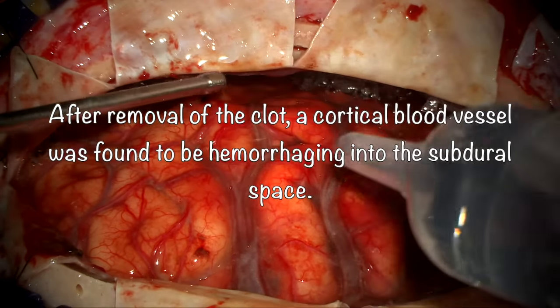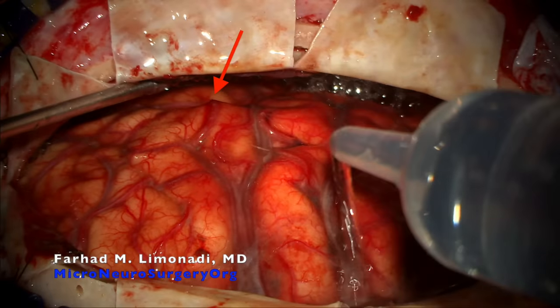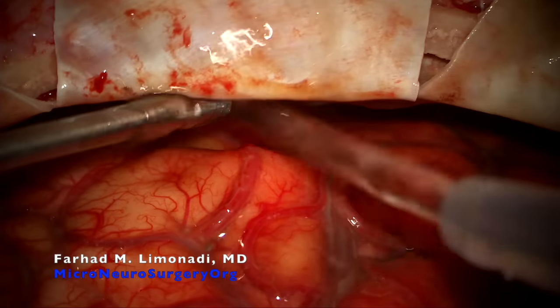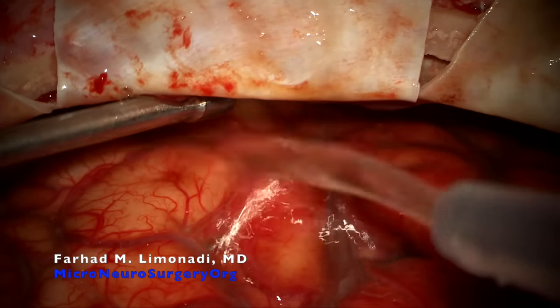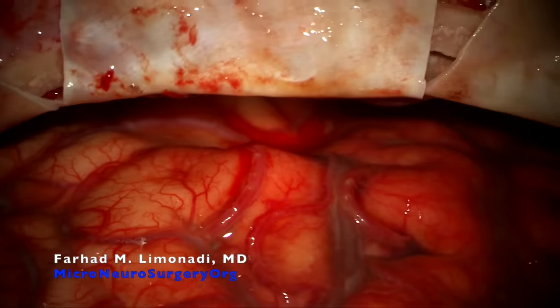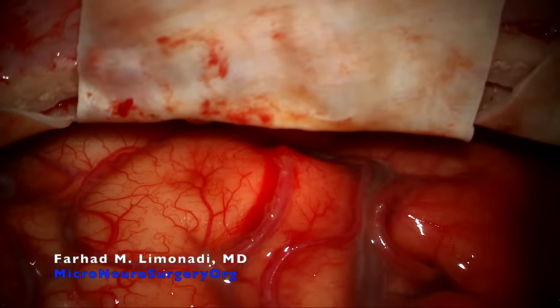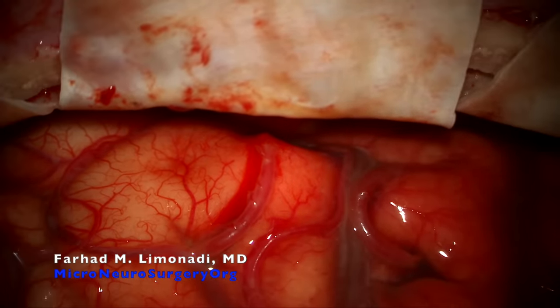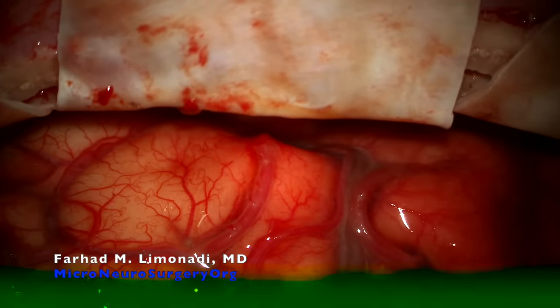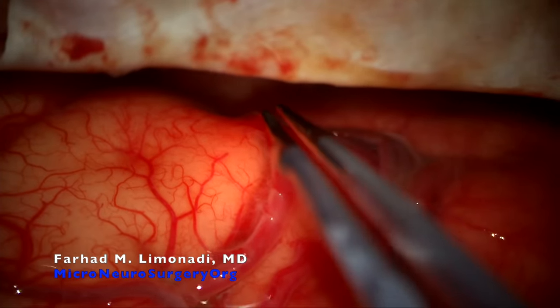After removal of the clot, a cortical blood vessel was found to be hemorrhaging into the subdural space. This blood vessel may very well be supplying the sensory motor cortex, and therefore should be repaired gently and carefully. The sidewall of this vessel was carefully sealed with low current bipolar cautery, with the artery remaining patent.